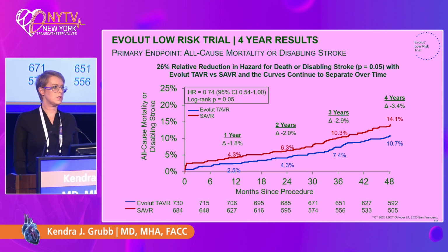Now, there are subtle differences in the percentages that I will not dive into at this point, but at this stage, what I can tell my patient is with the available data, and as a reminder, the PARTNER study and the low-risk Evolut trials will provide us also the most data on randomized controlled patients in the surgical arm, because we didn't do those studies.